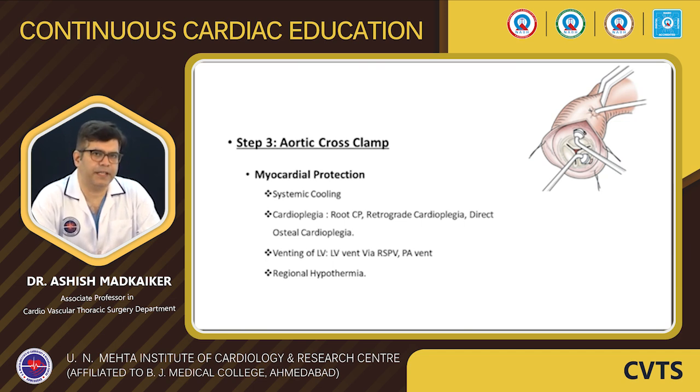Venting of the LV is very important. Usually it is done by putting an RSPV vent into the LV, and sometimes in minimally invasive or redo situations, it might be difficult to put an RSPV vent. So we can vent either by a PA vent, or we can put a vent directly into the LV across the aortic valve. Regional hypothermia with cold saline or ice is again an individual's choice or preference. It again helps to decrease the myocardial activity and has a better effect on myocardial protection.